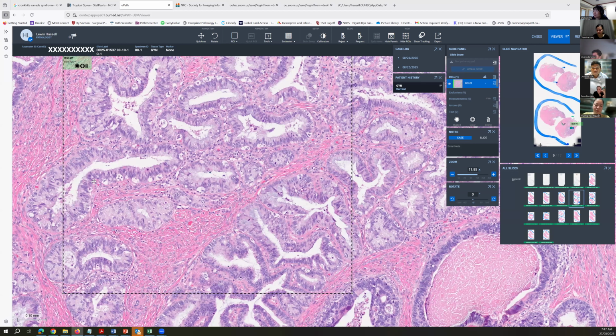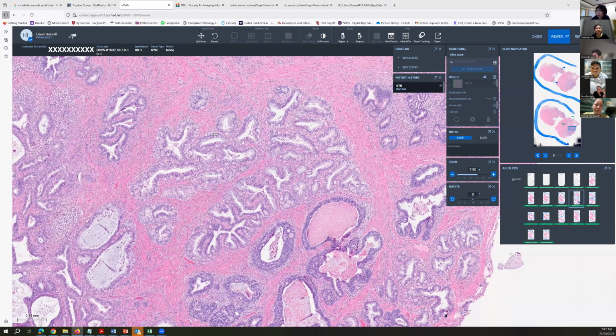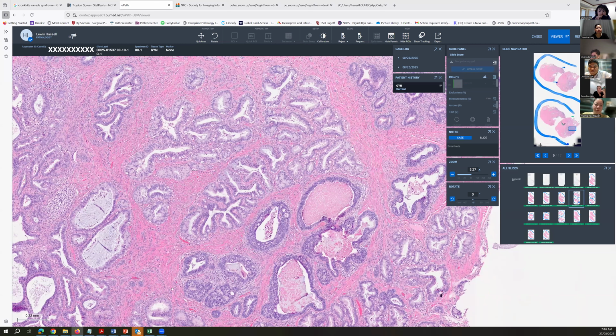which, if it's an isolated disease, is called SMILE, stratified mucinous intraepithelial lesion. Here, I just called it mucinous disease because I'm not completely sure if it's invasive or if it's still in situ. Now, admittedly, this is a relatively small focus, so it's certainly not the major disease. But this is a disorder that often has accompanying squamous neoplasia, and in fact, in some situations, will lead to an invasive adenosquamous type of lesion as well.